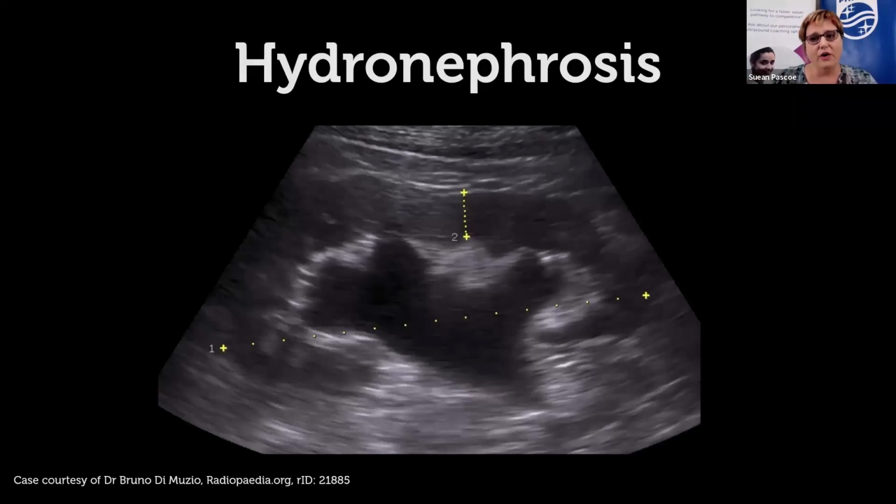So it's important to know, I think, before you go calling something hydronephrosis, you must have a look at the bladder to make sure that it's empty. And if the kidneys are still then dilated, then that's real hydronephrosis. But if you had some hydronephrosis and you had a really full distended bladder, then you have to be questioning, is that just backing up in the system because the patient just needs to go to the bathroom?